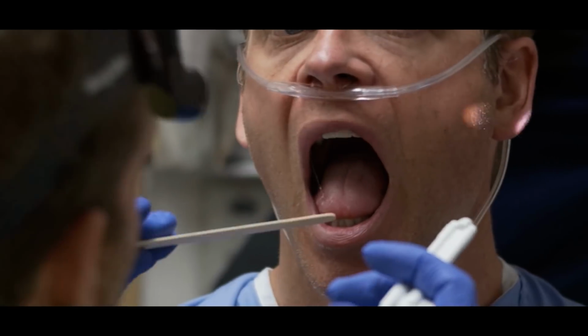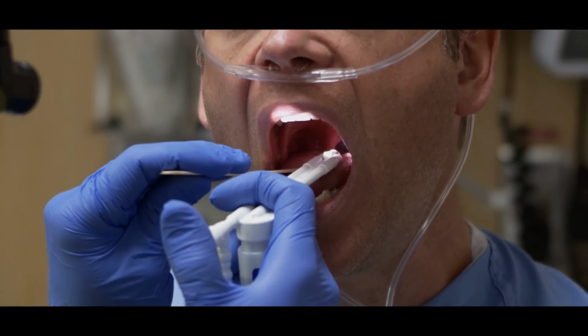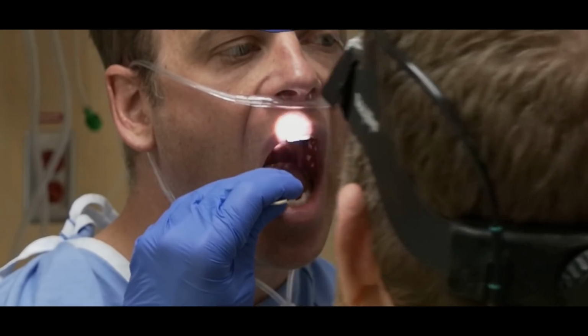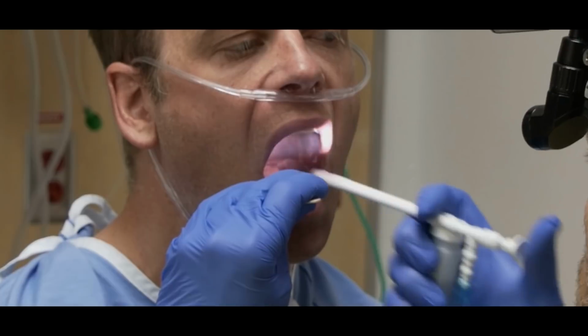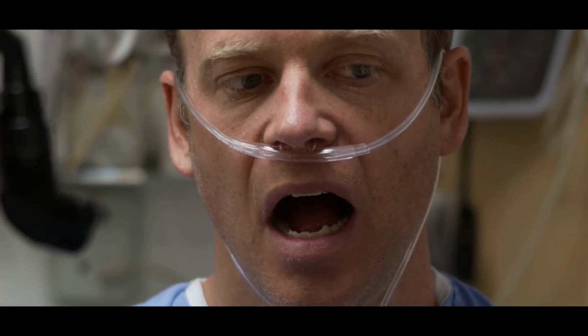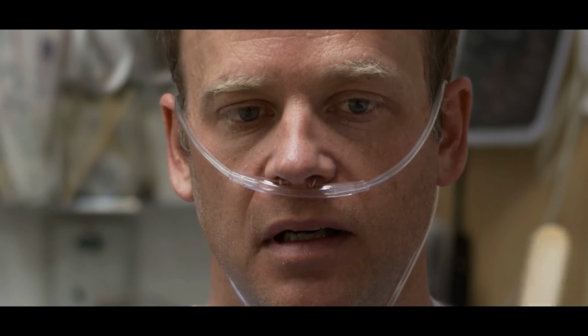And now I'm going to aim at the palatoglossal folds where the tonsils used to be. A little bit on that side. A little bit on that side, and we'll just let that sit there for a second. And then this has a directional tip.